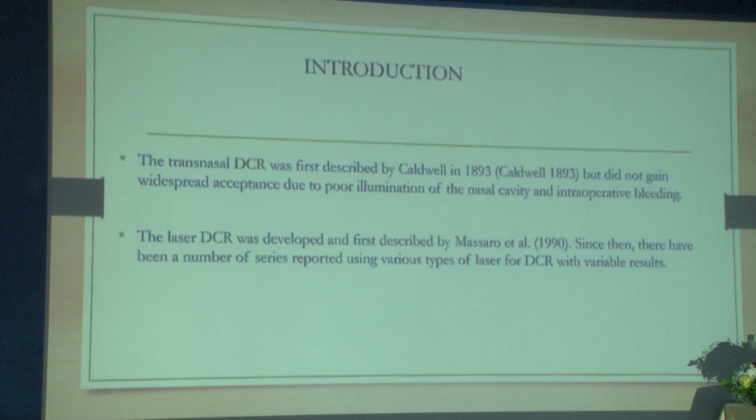Transnasal DCR was first described by Caldwell in 1893, but it did not gain popularity due to poor illumination of the nasal cavity and intraoperative bleeding. But nowadays, with the advancement of newer techniques and technology, these techniques are gaining wide acceptance and most people are doing them. Laser DCR was first described in the 1990s by Massaro et al., and many papers have been published with different results.